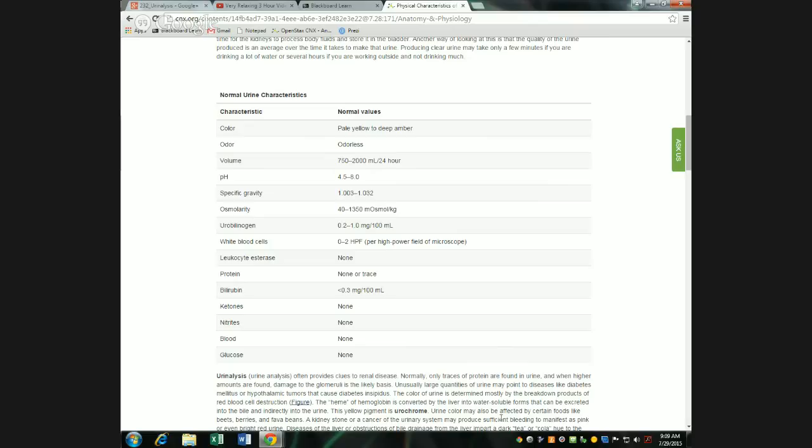What you're smelling when something smells sweet are ketones. Ketones are metabolic products of glucose, or not glucose, but carbohydrate metabolism that build up when people have certain metabolic disorders. Diabetes might be one of them, but more likely it's some sort of ketonuria. If you've ever looked at the warning label on anything that's got NutraSweet in it, like Diet Coke, it'll say PKU danger or something like that.